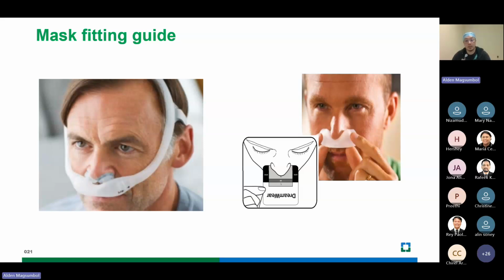For the under-the-nose nasal cradle or nasal mask, if you are using a nasal cushion sizing guide included in the mask, hold it horizontally under the nose, then select the cushion size based on where the outer edge of the nostrils and tip of the nose contact the gauge. The cushion opening, which is the triangular opening, can be directed under the nostrils. So this cushion will hug the nose and leak should be at a minimum level.